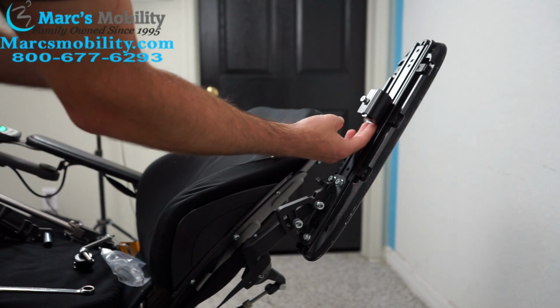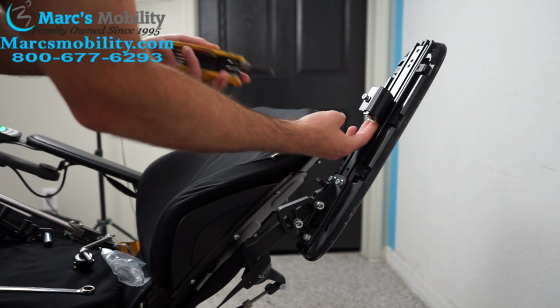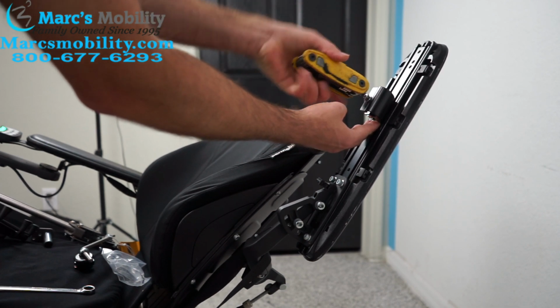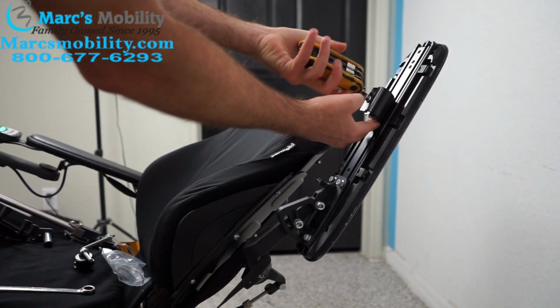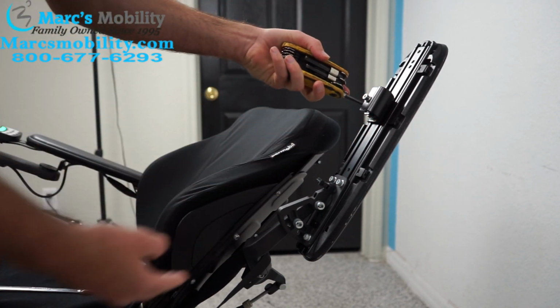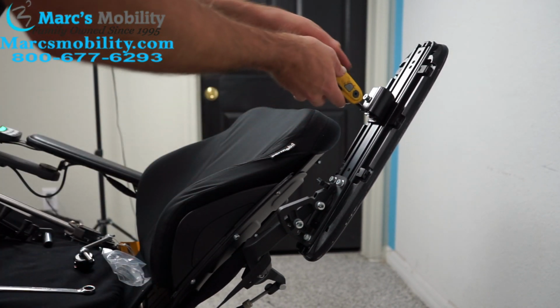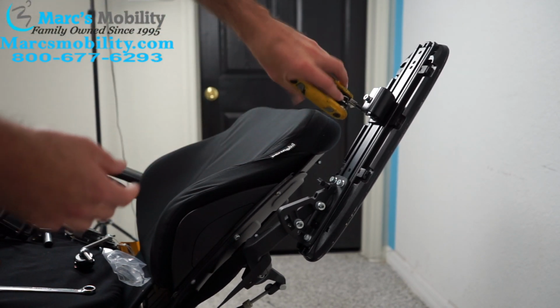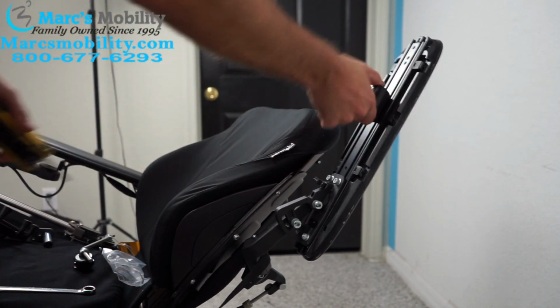And then wherever you want it, I've got a 5mm Allen wrench. I'm just going to tighten it. And your Permobil probably comes with a toolkit with the right size wrench for this. So just tighten these 2 screws. There we go, that's not going to move.